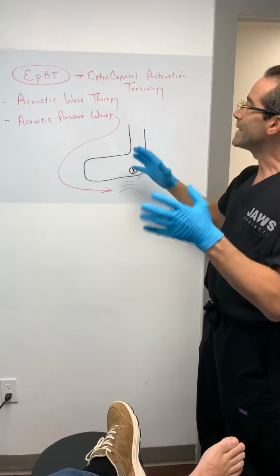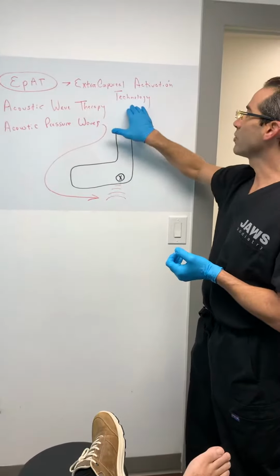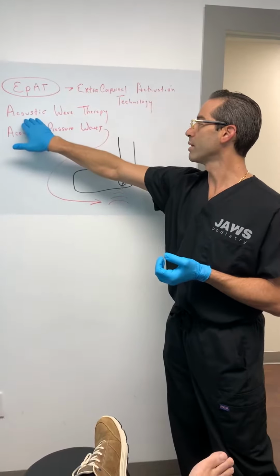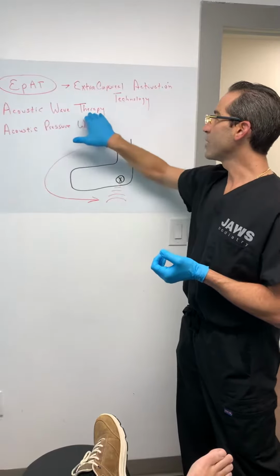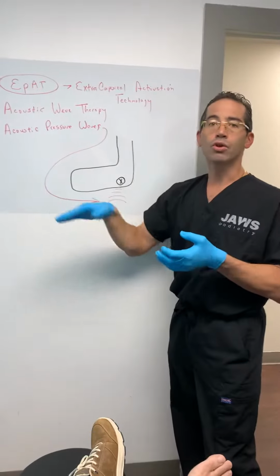Again, there are different names. EPAT, an acronym for extracorporeal pulse activation technology. Also, people will use acoustic wave therapy, acoustic pressure wave therapy, radial shockwave therapy.